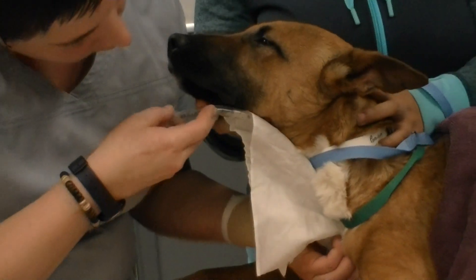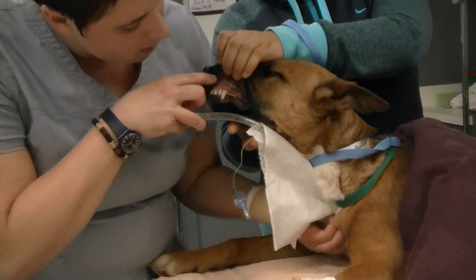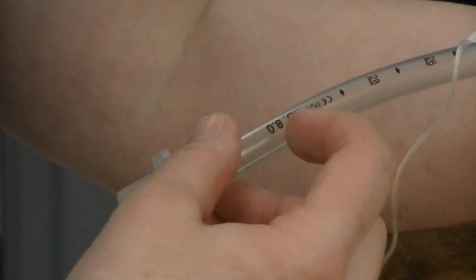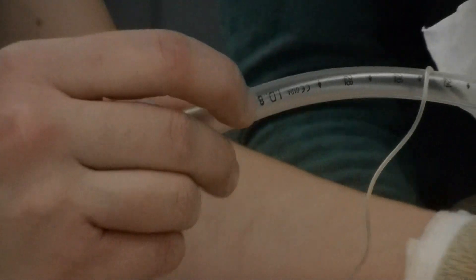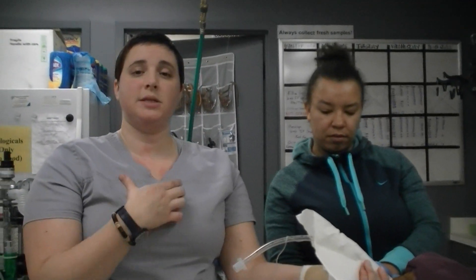I'm going to follow the gentle curve of her neck and see where we're at. We're at the ID marking, so it's about 30 — we have 28, 29, and she was right about here, so that's going to be 30 centimeters. I want to keep that in mind and know exactly where I want to go. The reason for that is at the point of the manubrium we have the tracheal bifurcation, which is where the trachea splits into two bronchi.